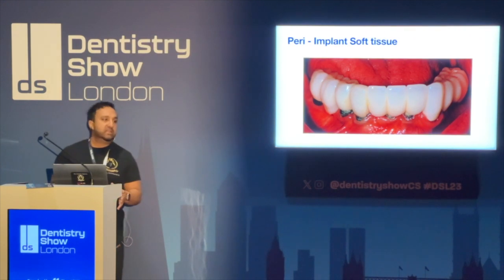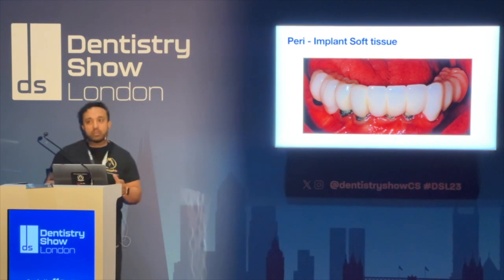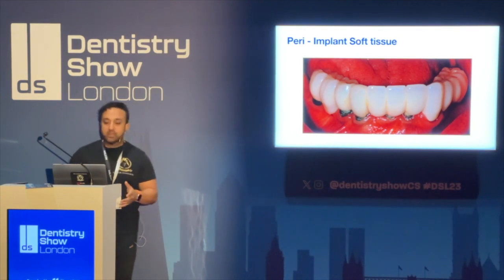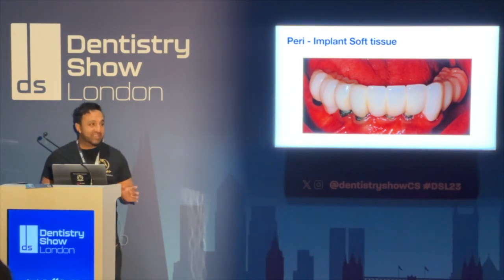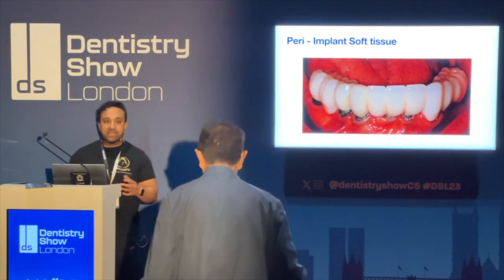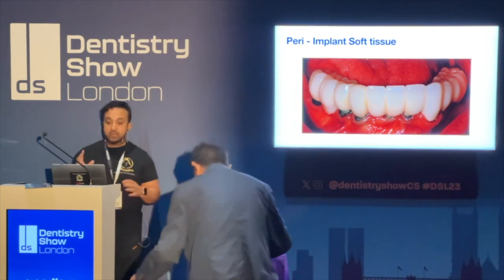It's been done. In this particular case, this patient of mine basically had this done abroad about 15 years ago. So it's been 15 years in function. Is it a failure? Well, not really. It's not a failure, but we need to manage the situation going on. And the way you manage it, number one, is you get rid of the plaque that you can see. Okay? So you can use air abrasion technology, and you can clean that up, and you can air abrade the exposed threads. Okay? That's number one.